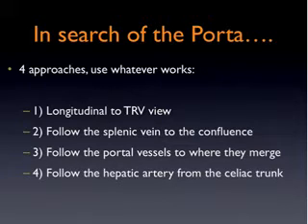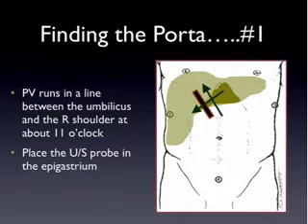You can follow all the portal vessels distally to proximally, where you'll see the main portal vessel in the Mickey Mouse view. Or finally, you can follow the hepatic artery from the celiac trunk. Let's talk about these each in detail.